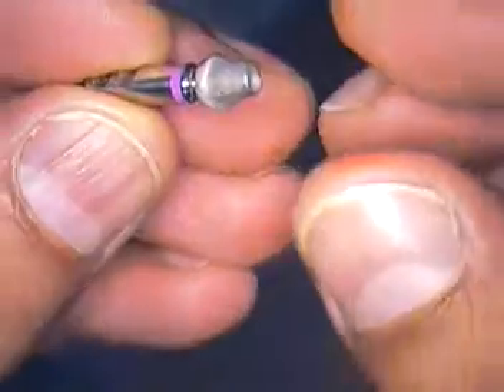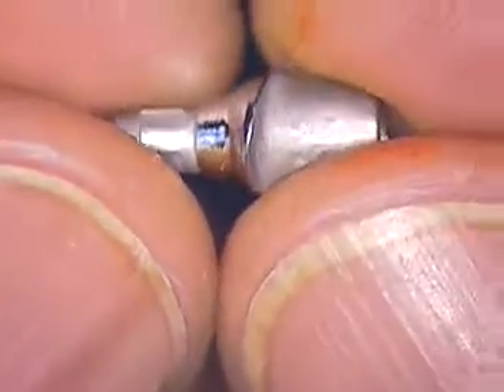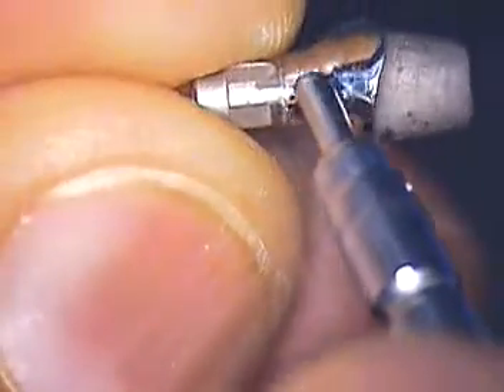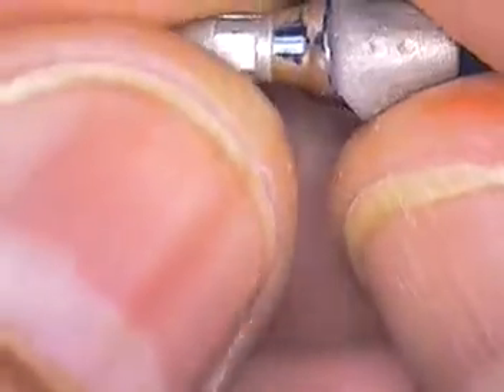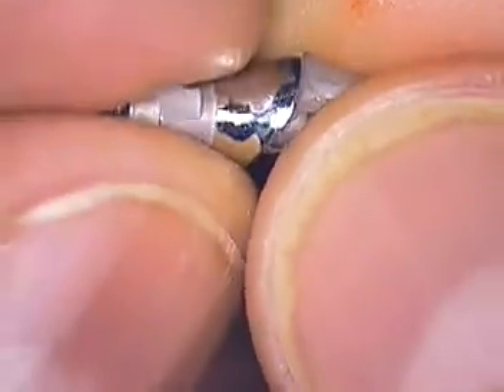I left off last time with the abutments that were made by my lab and the case fabricated, but we had a little problem in the emergence profile area here. We had a little lip and I asked my lab to remove the lip and to polish this. It looks like they did a fairly decent job for the bicuspid and the molar — tooth number 30 and 29.